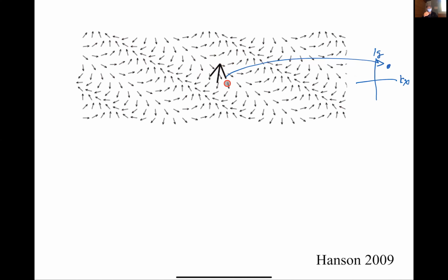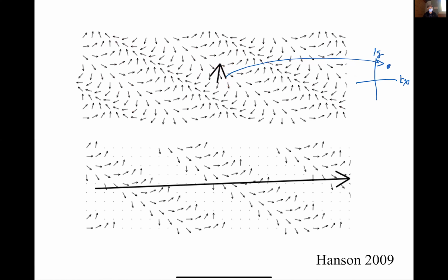But now let's consider changing my object. I'm going to take that bar of chocolate and imagine cutting diagonal stripes out of it, so I'm actually making my object look more like my Fourier component. That's shown here, right? All these here are all 0 now, because I just removed the chocolate from those parts. Not having spins there is essentially like multiplying by 0. So my object is 0 here, and it's got a value here.